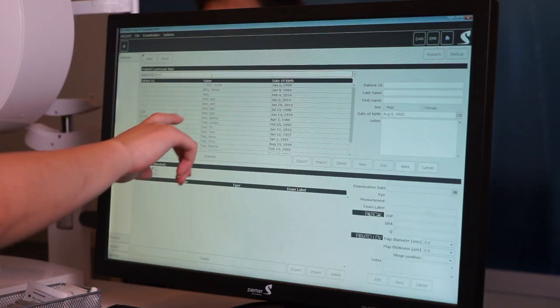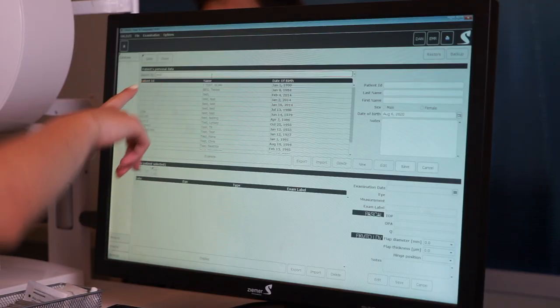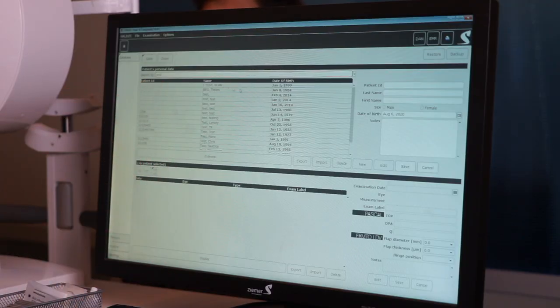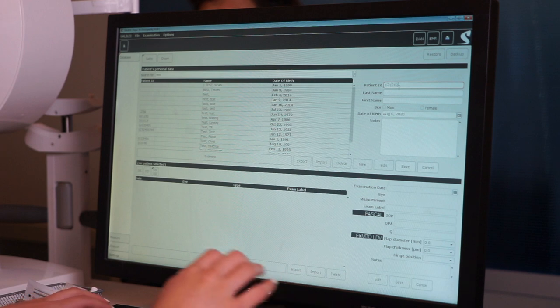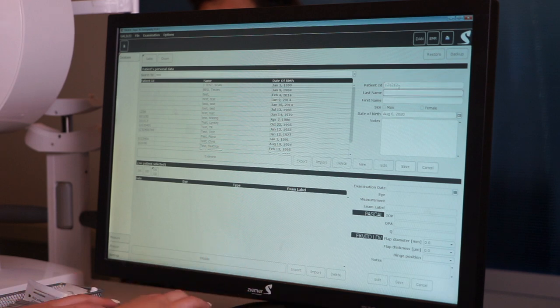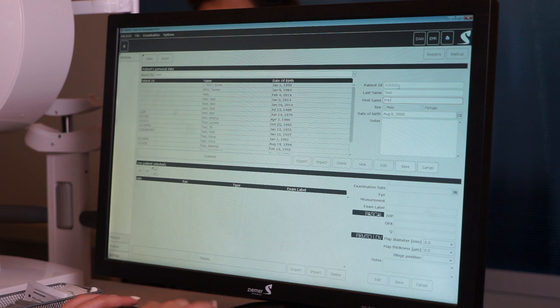You're going to search for the patient's first or last name in the search bar. If it doesn't show up, hit New and enter the patient ID, last name, first name, sex, and their date of birth.